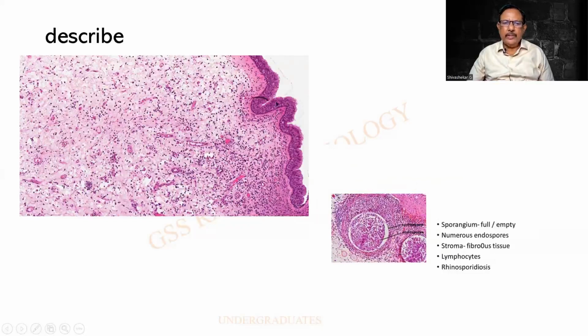But then look at this. There is again an epithelium. It can be a pseudostratified columnar epithelium, but then the subepithelial tissue is edematous. Look at this lot of empty spaces that we are seeing. That is because of edema. There are a lot of blood vessels also. Again, our friend, look at these numerous dots. They are all inflammatory cells. It can be lymphocytes or eosinophils. In this case, it is lymphocytes.